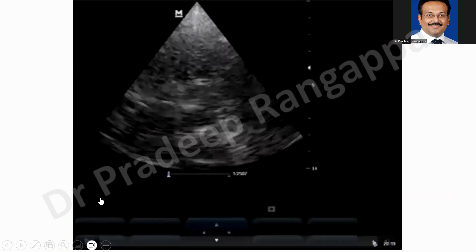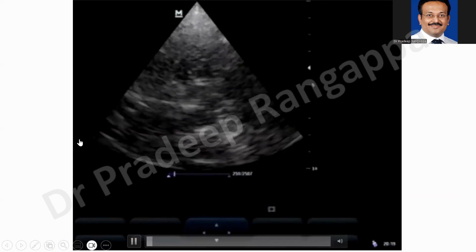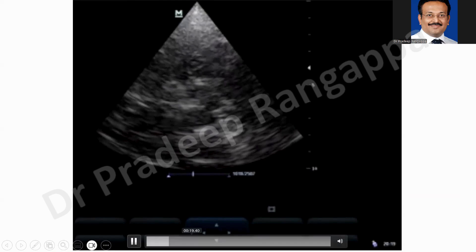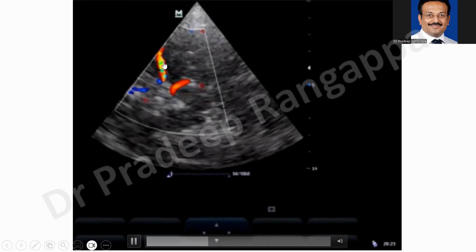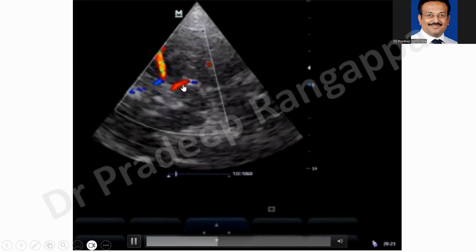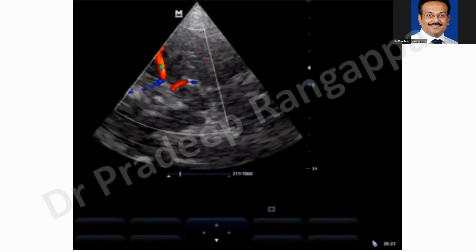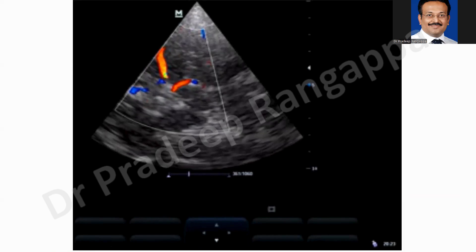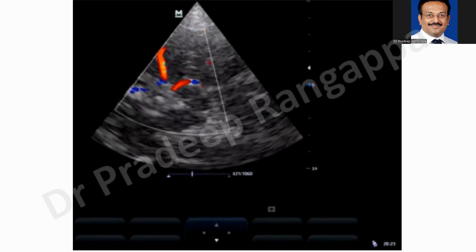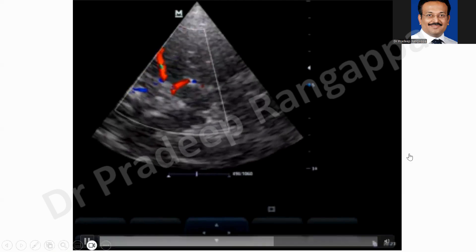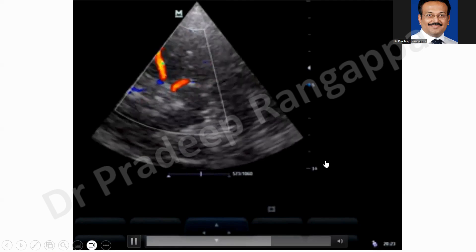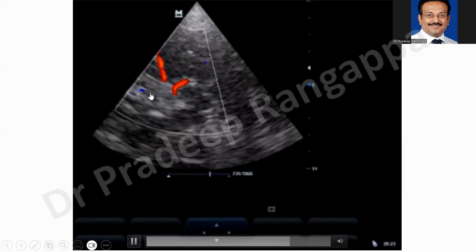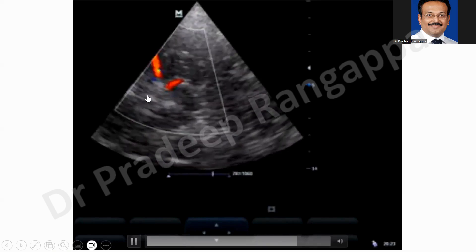This video shows the circle of Willis as it looks when you place the transcranial Doppler. You can see the MCA appearing as a red blob. One can identify it by looking for the sphenoid bone, though it's not always easy to pick up. Once you see this red vessel, that is the MCA. Here the depth is around 60 to 70 millimeters with the overall depth set at about 10 centimeters. You can also see the circle of Willis slowly coming in — the blue vessel is the anterior cerebral artery / anterior communicating artery.